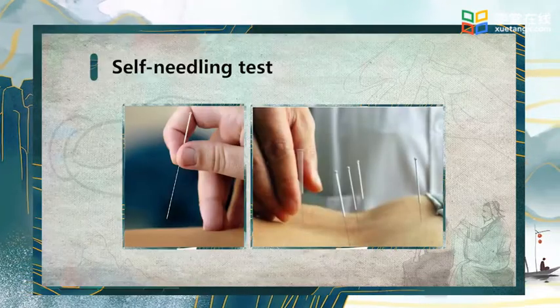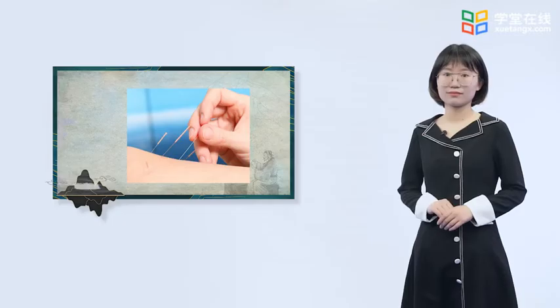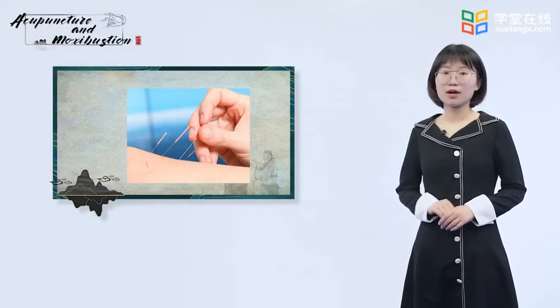And finally, we could change the cotton ball to the body. Try to insert the needle into your skin surface. Of course, you could practice with your partner. In Chinese, there is an idiom: practice makes perfect. Try to practice more and more, and you will acquire this technique quickly.